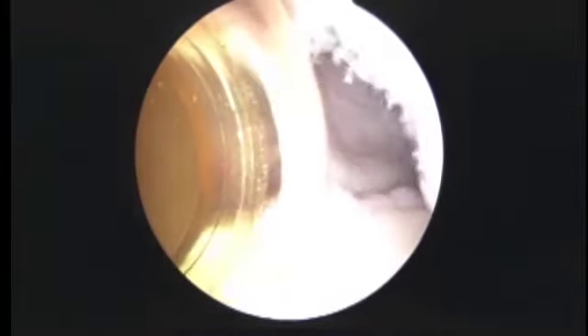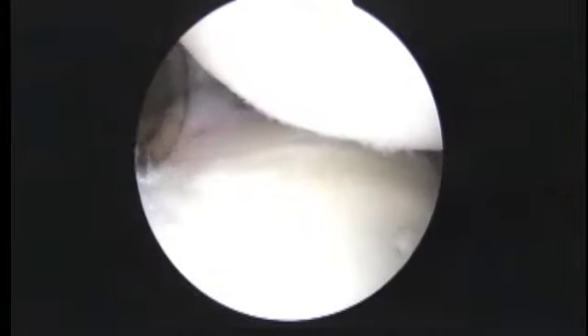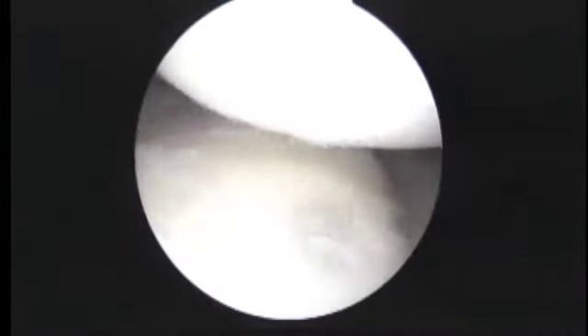We've passed all the sutures from that anchor in the back of the humeral head. When we pull tight on these, you can see how it's going to bring that head back nicely — just like that. It reduces it. We're not going to tie those now; we're going to tie them at the end. The next step is to go ahead and get to work in the front of the shoulder.